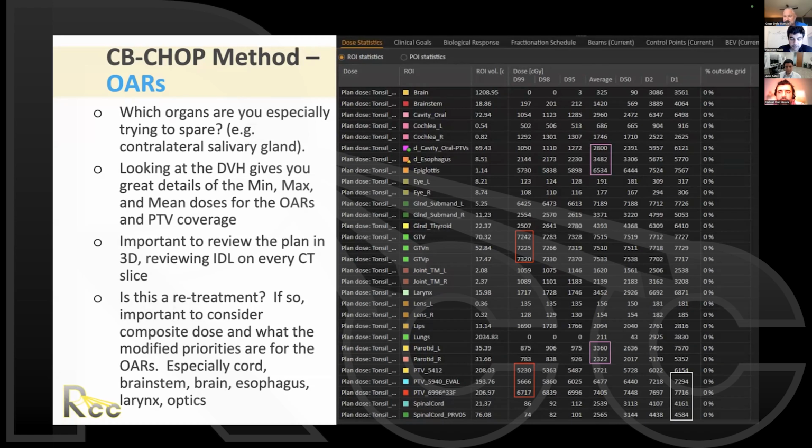Yeah, I agree with everything. I would say, as the physicians, when you're contouring, one thing you're keeping in mind, you're already thinking ahead of the plan you're going to get on the other side, and being able to communicate to your entire team. For example, if you have a tumor that's invading or abutting the parotid gland, and you want to deposit 70 gray into that volume, you already know you're not going to be able to meet that constraint. And so having that understanding up front, your team will know this: if you try to spare the parotid too hard on that case, your coverage will go down.